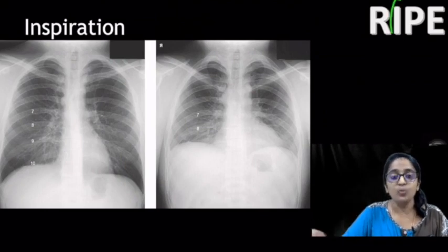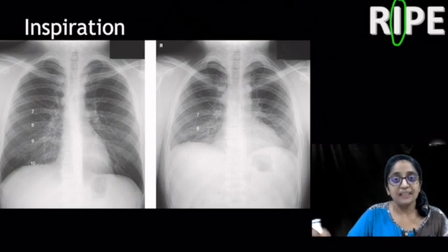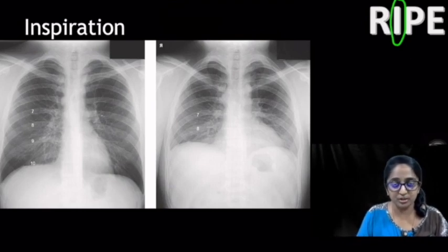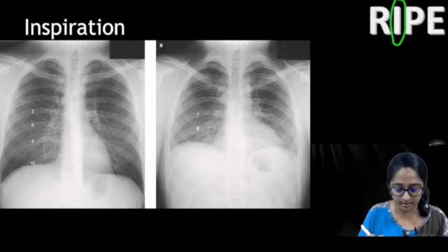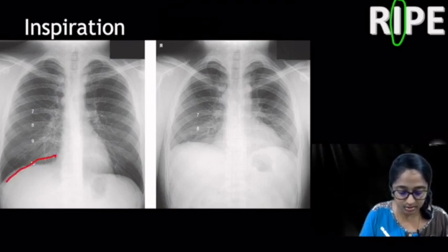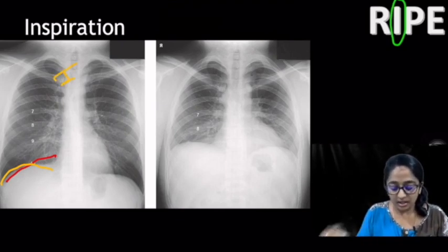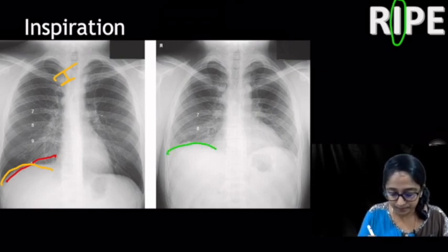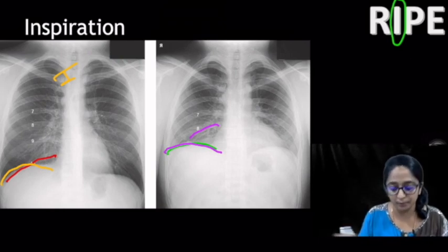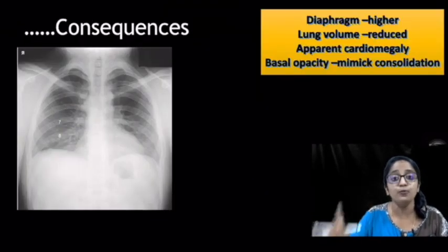Next, assessing the inspiratory and expiratory status of the radiograph. The frontal projection chest radiograph should be taken in adequate inspiration, such that the 10th posterior rib cuts across the dome of the diaphragm — this is an inspiratory film. If only the eighth rib crosses the dome of the diaphragm, this is an expiratory film. Let's see the consequences of an expiratory film.